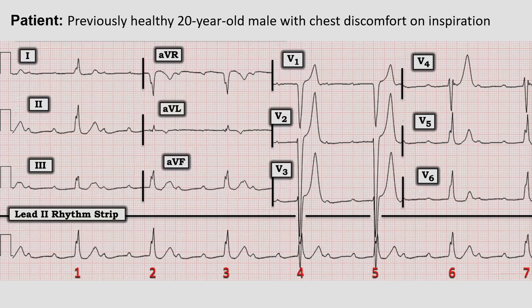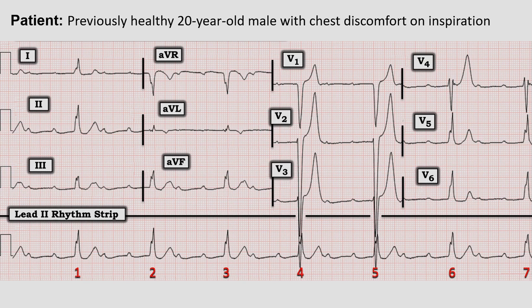Here we have an ECG taken from a previously healthy 20-year-old male with chest discomfort on inspiration. Take a moment to review the ECG, try to interpret it yourself, and pause the video. When you're ready, start the video and we'll go through this together.